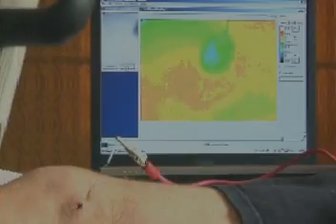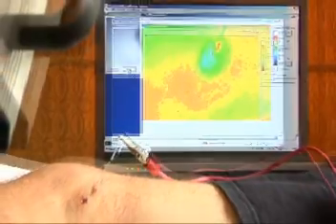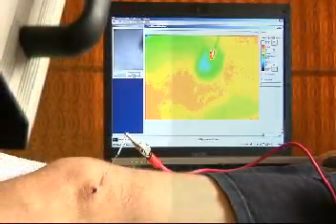Okay, now we're going to turn on the camera so we can see what's going on. You may feel it, you may not. If it's too hot, just tell me I'll turn it off. That's why we like to keep you right on the edge. We want that heat just to expand.